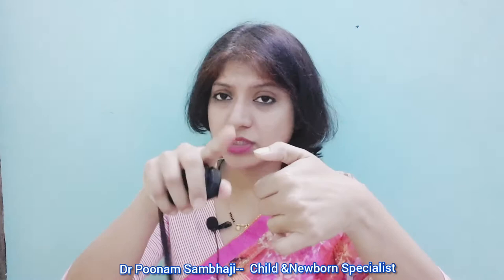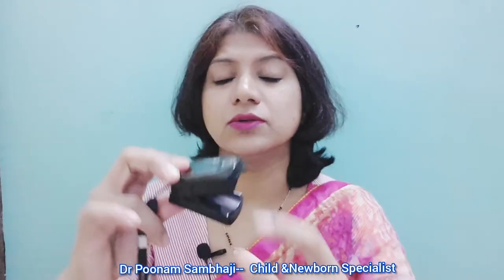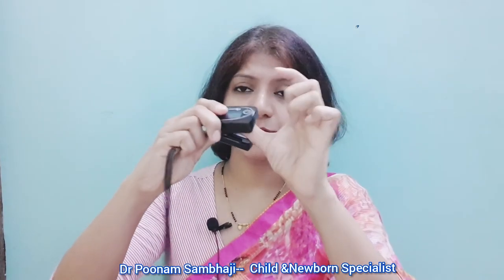Few things that you should remember while using the pulse ox: babies or anyone who is using it, the nail should not have any nail polish or color. Remove it or use another finger. In kids, preferably use this middle finger because it is long and it will reach this sensor, as I said in the video. Also remember, the finger should not be wet, there should not be much moisture, as well as there should not be much coating of powder. And you should also clean the pulse ox regularly so as to get proper readings.